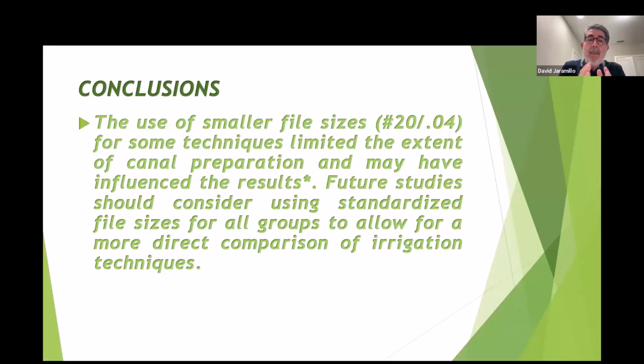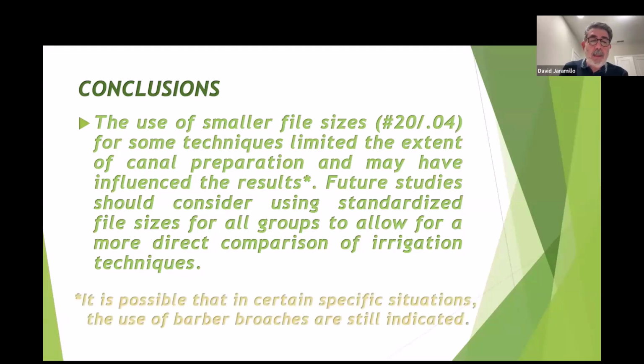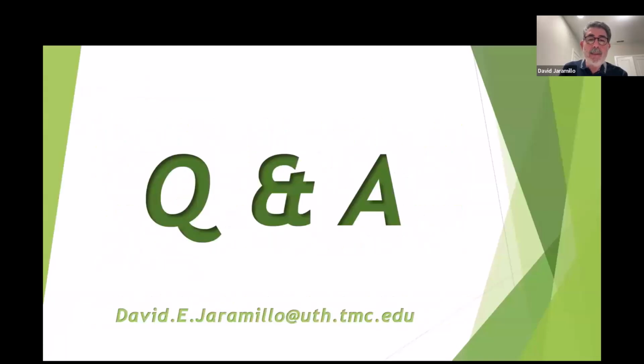That's fine. You can do a small instrumentation and then run your technology and then keep incrementing, because I strongly believe, especially in vital cases, that we need to help debride the pulp tissue with files or with barbed broaches. It is possible that in certain specific situations, the use of barbed broaches is still indicated.